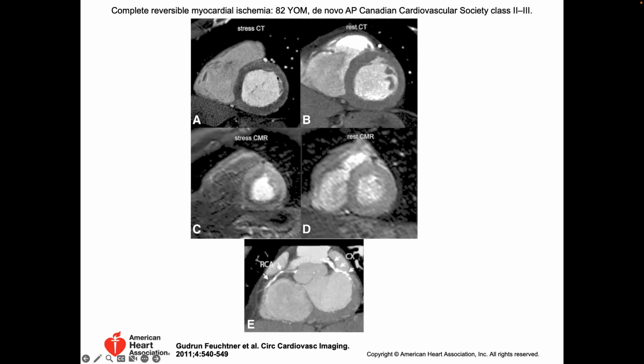You could get everything. But in MR, you get the signal response that looks something like this. In the rest case, this patient has sort of normal flow compared to the rest of the heart. In the stress case, when the blood flow in the myocardium has gone up by, say, a factor of 4 in the normal tissue, it just can't make it in the tissue that has some problem upstream. So it's usually a stenotic vessel upstream that will not allow the flow to increase past a certain limit. And therefore you've successfully detected a myocardial perfusion deficit. So that person's positive. They have a positive perfusion scan.